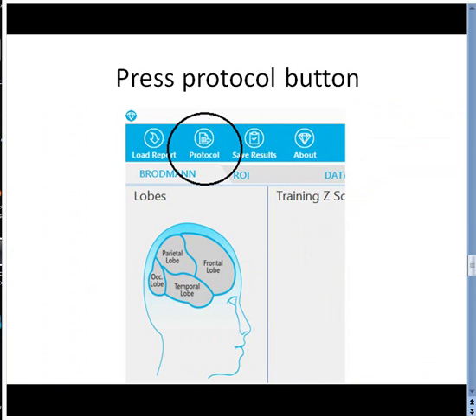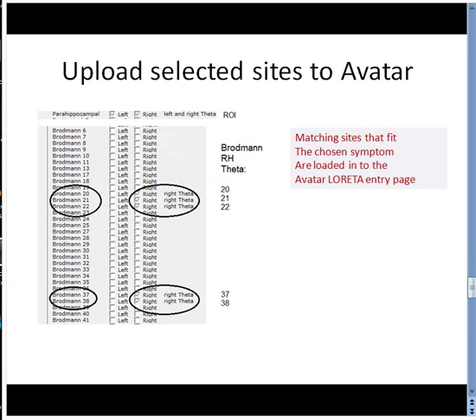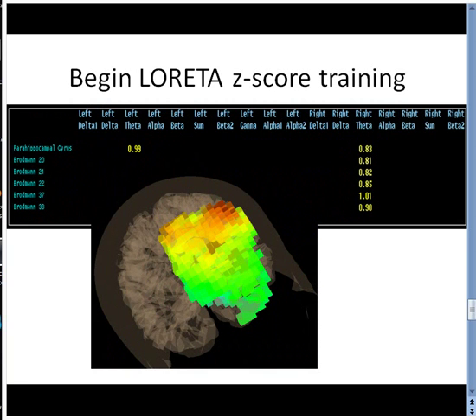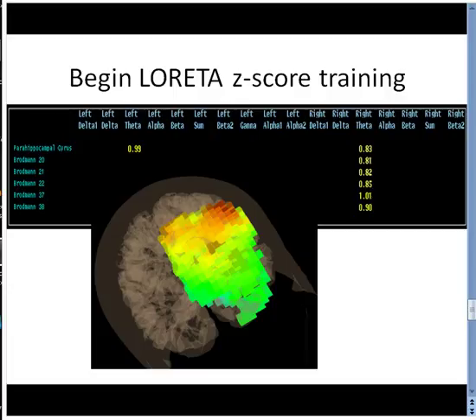Next, we press the protocol button. This uploads the selected sites to Avatar. Finally, we begin Z-Score training with the exact sites that we picked based on the matched symptom.